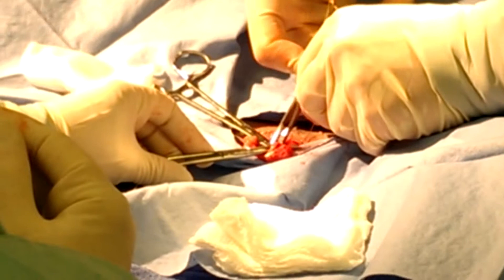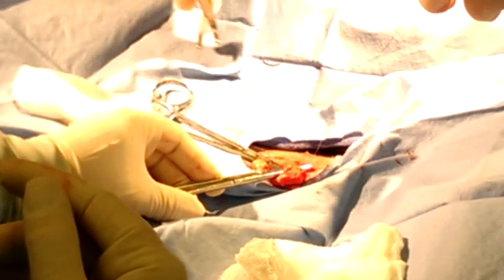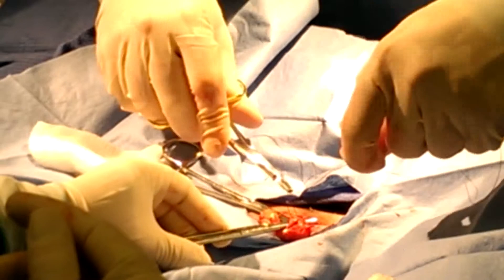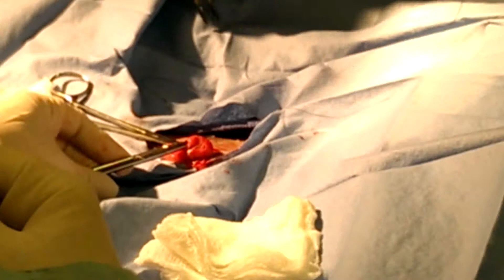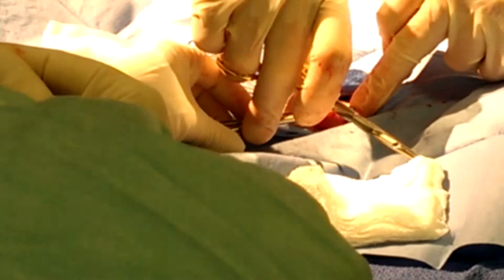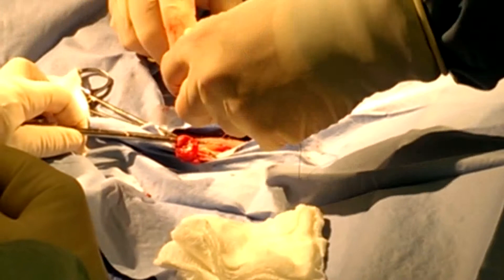I don't need a surgeon's knot on something like this — there's no tension. This is just a ligature; all it does is go around. Four throws — two knots, which is four throws. Leave about two millimeters — not too close to the knot, not too far. This is absorbable, but we don't need to leave any extra in that's still absorbing.